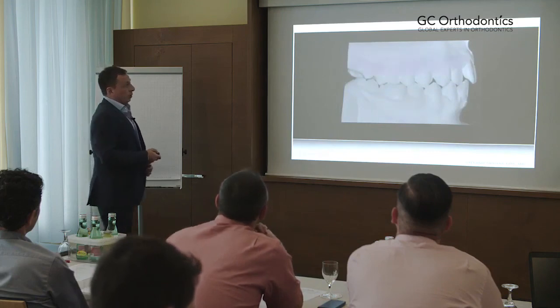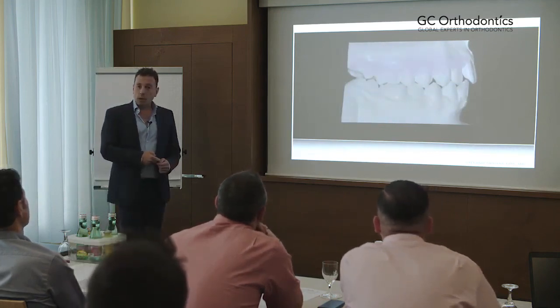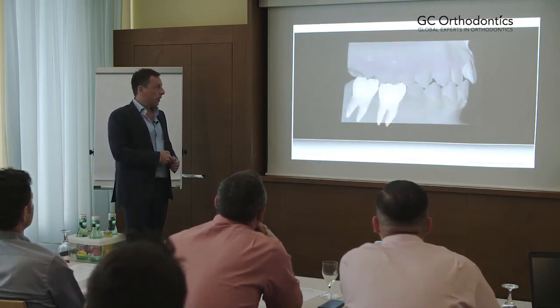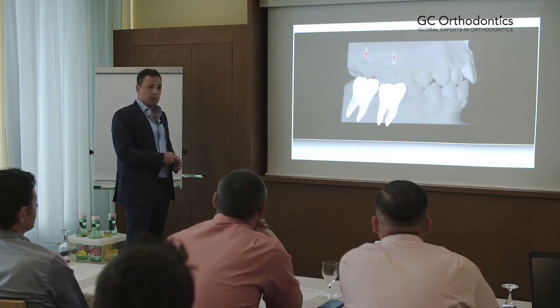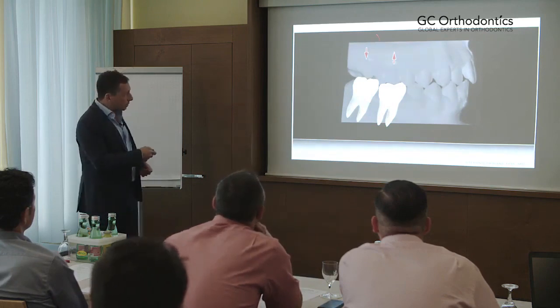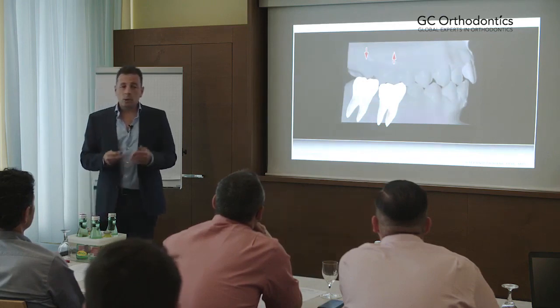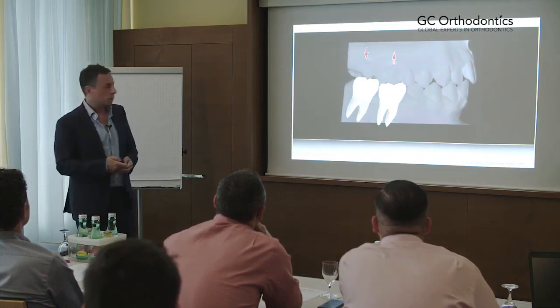This is interesting for you, because if you have such a situation that is an over-erupted second molar, if you just insert an arch wire here, what will happen is that you will tend to get an extrusive force on the first molar, which will be expressed very much, because extrusive forces immediately work. An intrusive force on the second molar will work much less, because intrusive forces take longer to express than extrusive forces.